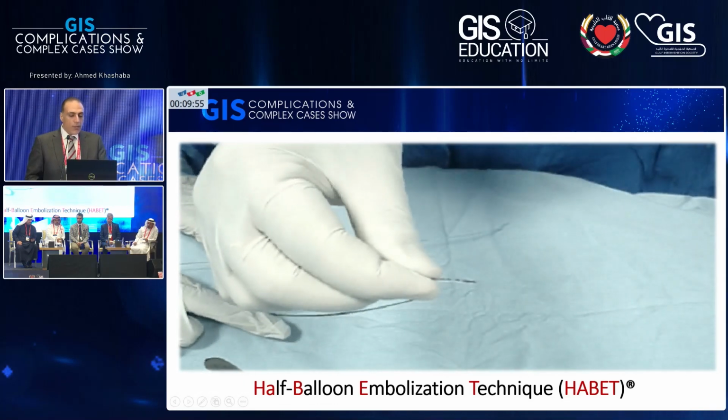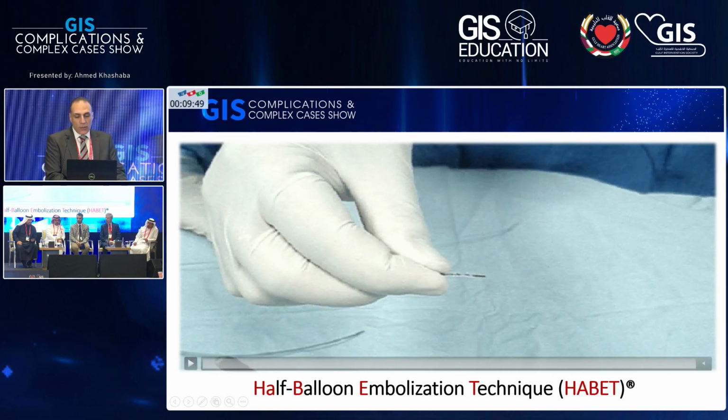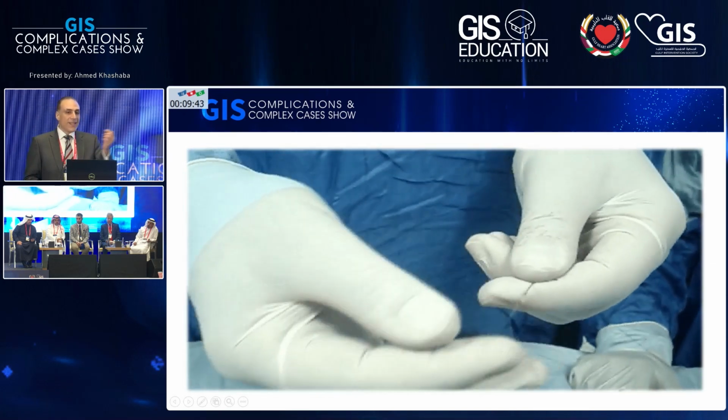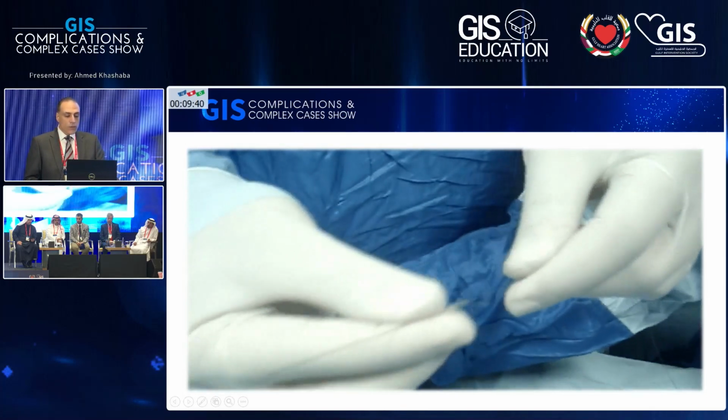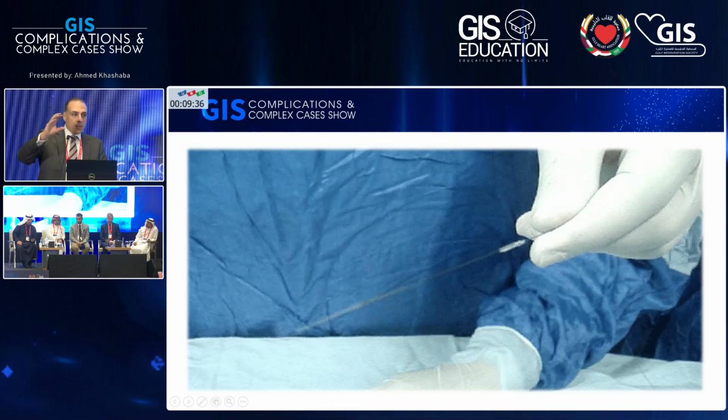So here you can cut any used balloon, the size of which, according to the size of the vessel, you cut the balloon between the two markers, just in the middle. And then you load this distal part of the balloon, same direction as the regular balloon over the wire. So you have basically half balloon with the shaft, and the balloon itself is doing like a basket.